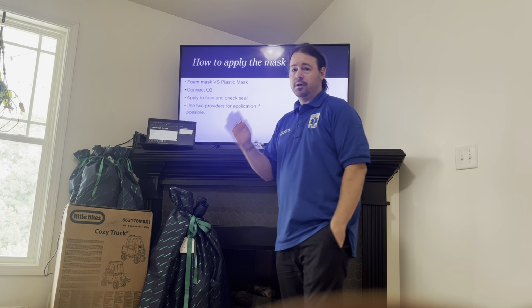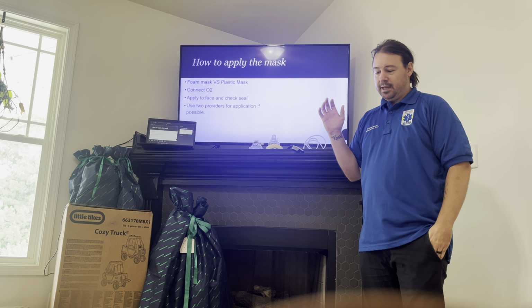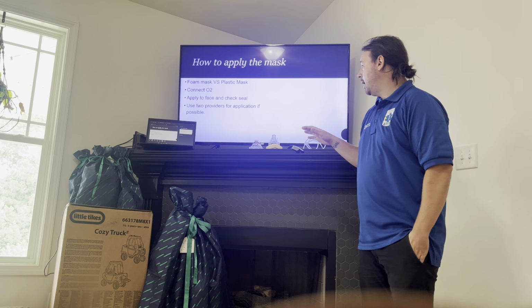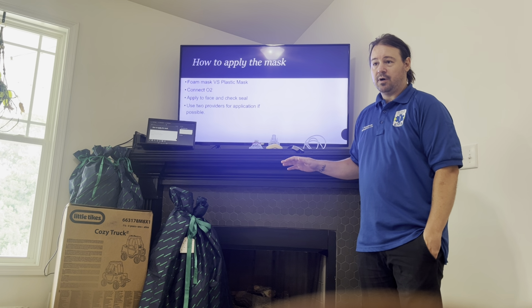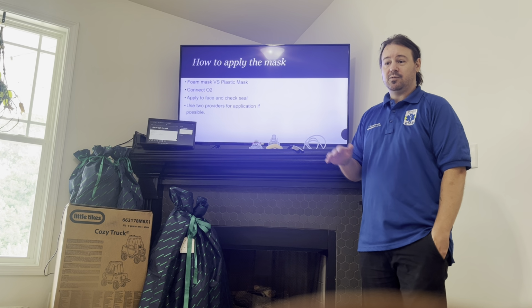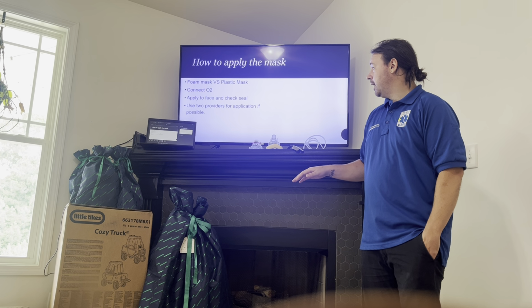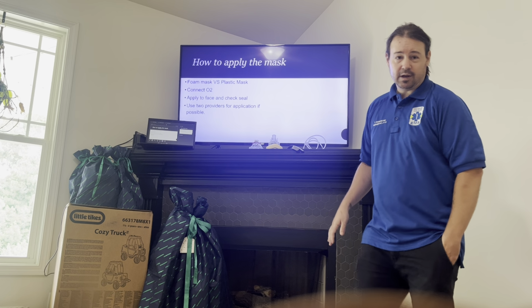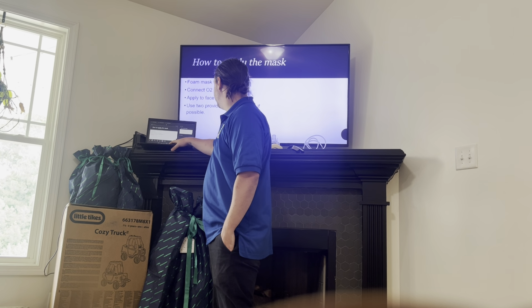Like we talked about earlier, we want to use 2 different providers to maintain that seal to the best of our ability. If that is not possible, absolutely CPAP can be placed with a single provider. It just does make it a little more difficult, especially for somebody who's not done it that many times. If you fall into that category and you have the opportunity to use 2 providers, please, at all times, use 2 providers while you get comfortable with the application of CPAP.